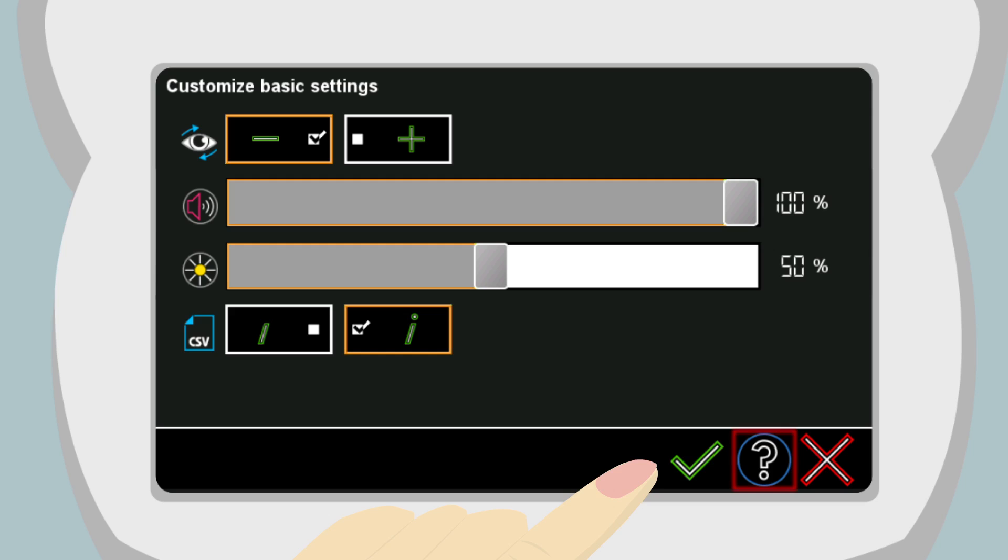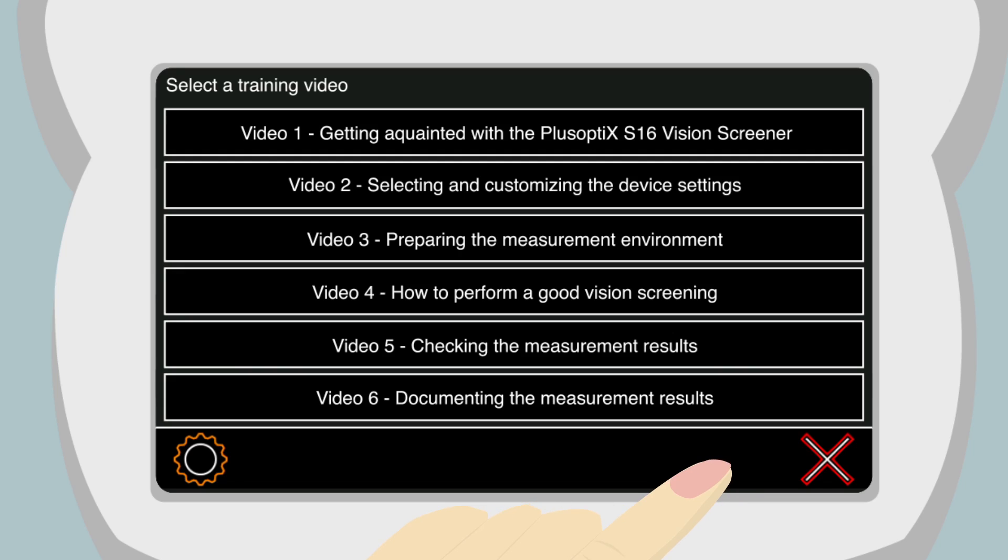Touching the Question Mark button will show a list of useful training videos. You can learn how to prepare the measurement area and how to handle the device. Please note, watching the training videos does not replace reading the user manual.